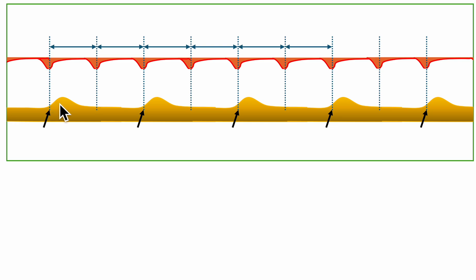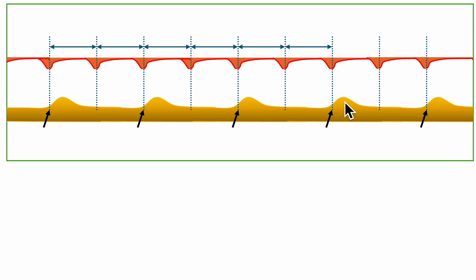This atrial contraction is coming with a fixed interval with the ventricular beat, meaning they are associated with each other. Alternate atrial beats are associated with ventricular beats at the same coupling interval — the time from atrial to ventricular contraction. This gives us a clue that this is a 2:1 AV block.